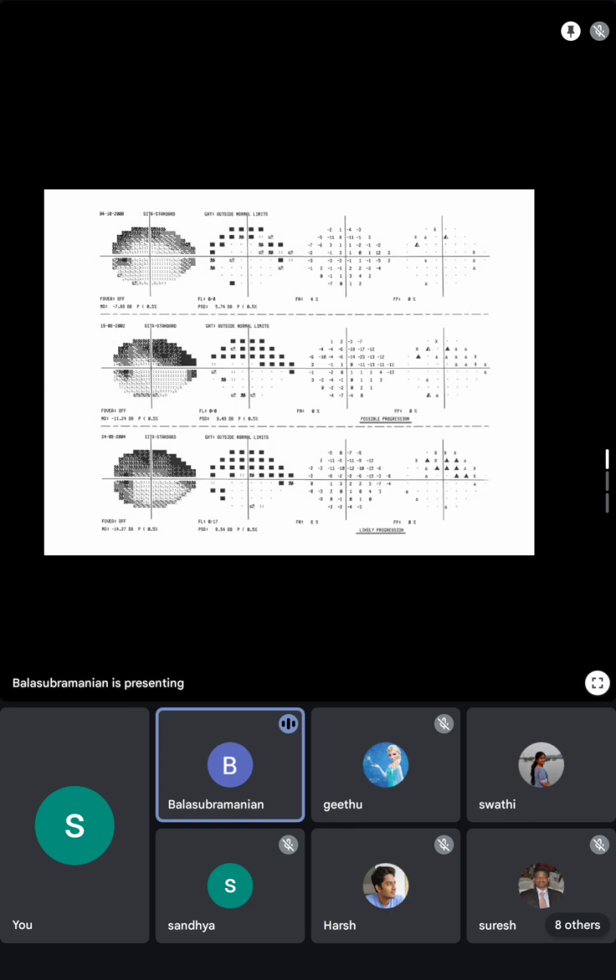So we cannot conclude based on this. That is why they say likely. They don't say it has progressed, because there is some PSD variation for which we have to find the reason. The PSD is relatively stable. Only the MD has varied more. Can you see that? Yes, ma'am. Can we go to the next?